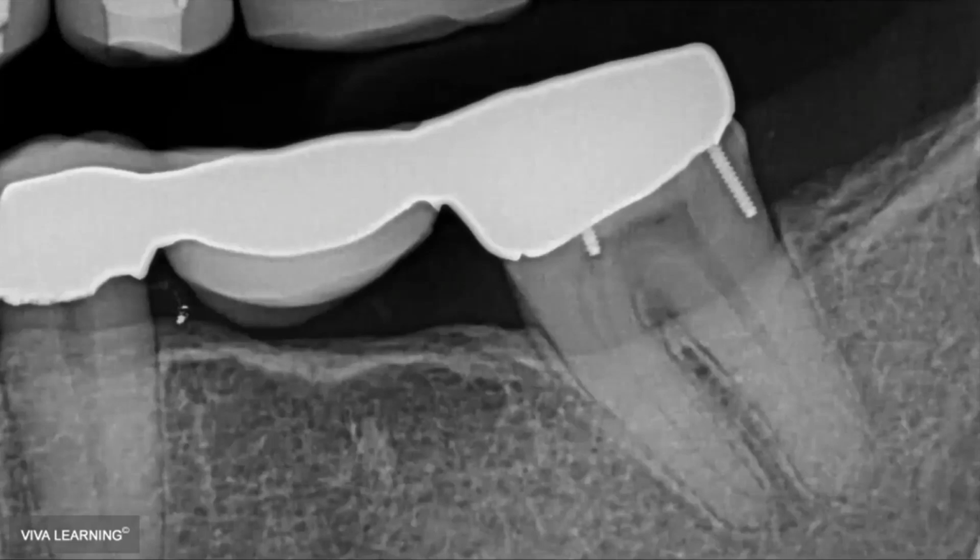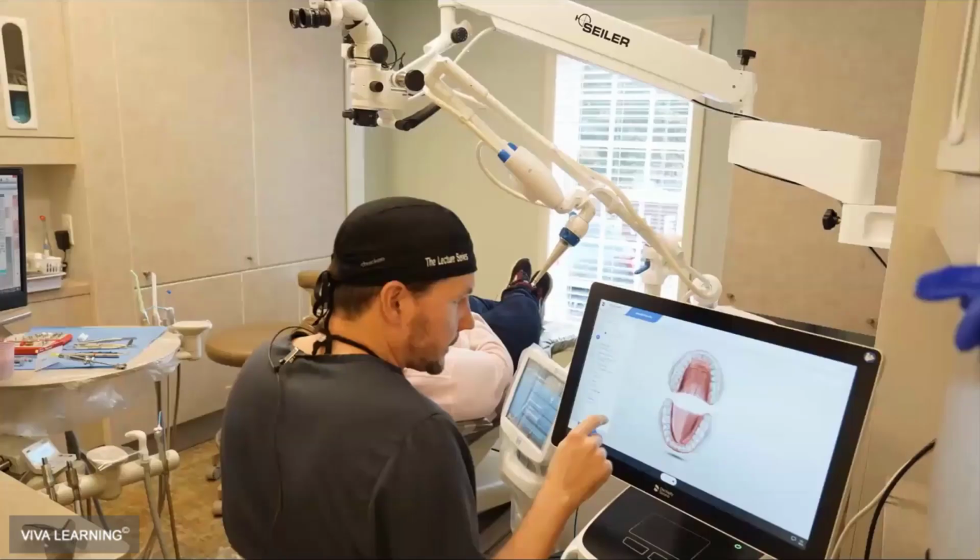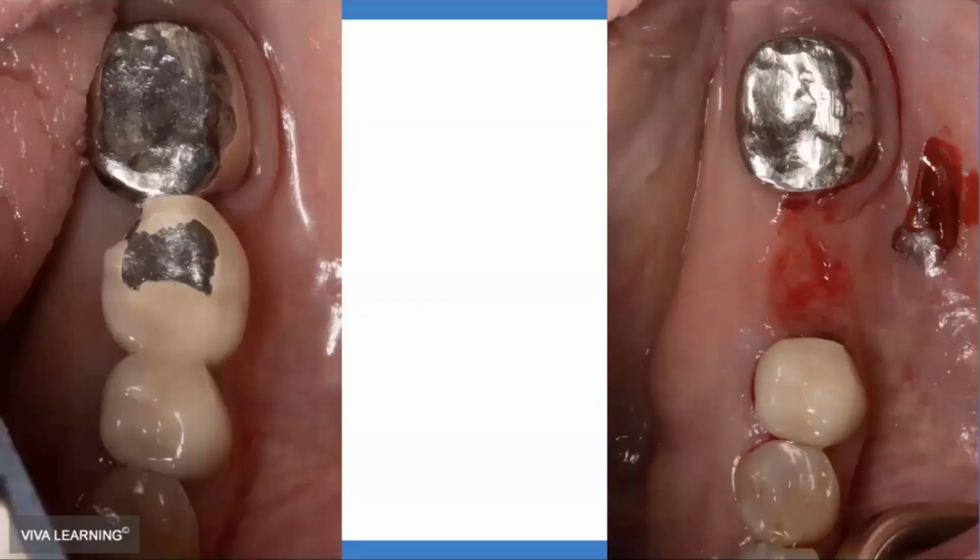So we're moving her to first molar occlusion. Number 18 is going to be extracted at some point, but until then, we're going to use number 18 to be a distal abutment for our guide that we're going to make. This case, first step here is we section the bridge.